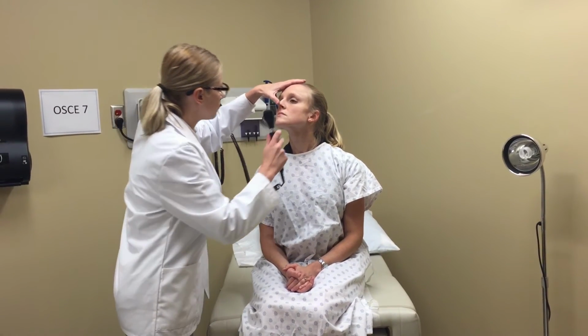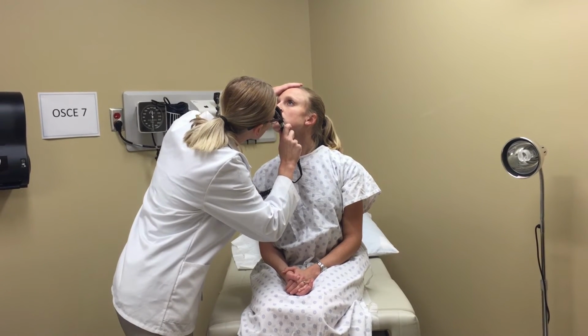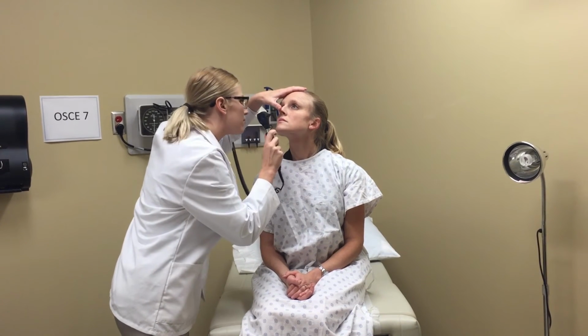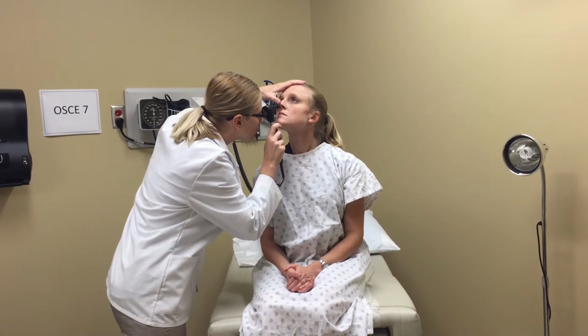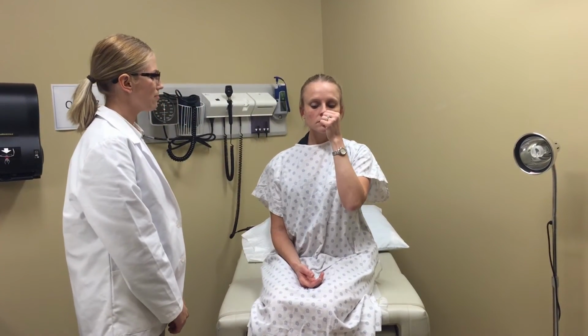Tilt the head to 30 degrees, pull the tip of the nose upward, and insert the otoscope into the most inferior portion of the nose. Note the inferior and possible medial turbinates, and ensure they, as well as the septum, are bright pink and without polyps. Patency will be evaluated by asking the patient to occlude one nare, breathe in and out, and then repeat with the other side. The external mouth and throat will then be inspected.